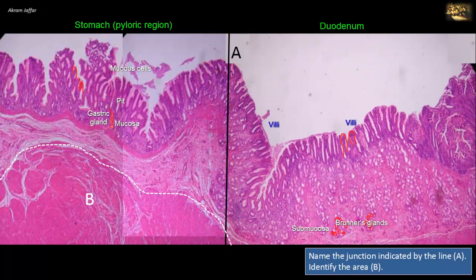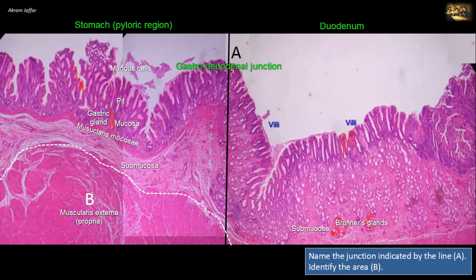The muscularis mucosa layer separates the mucosa from the submucosa. In the submucosa on the left side there are no glands, unlike the submucosa of the duodenum on the right side where Brunner's glands are visible. So on the left we have the pyloric region of the stomach, and on the right we have intestinal villi and Brunner's glands in the submucosa representing the duodenum. The junction is therefore a gastroduodenal junction. Region B is a thickened area of the muscularis externa where the inner circular fibers are thickened to form the pyloric sphincter.